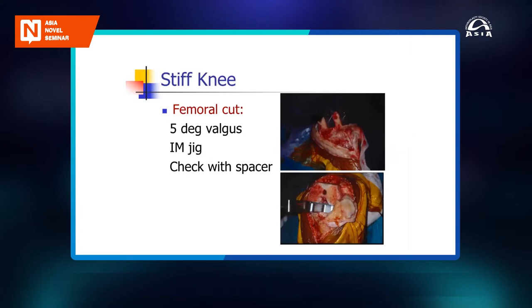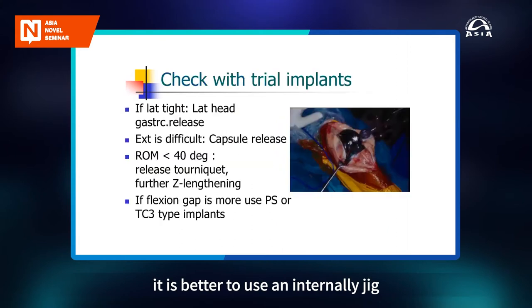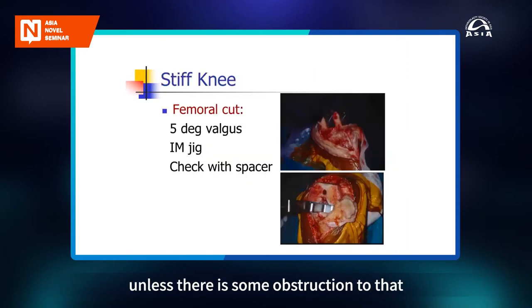As I said, on the femoral side, you make a similar cut, but on the femoral side, it is better to use an intramedullary jig unless there is some obstruction to that. In which case, again, use computer assistance. Obstruction like a plate or a nail, something which you can't remove or don't want to remove and just want to let it lie there, and you cannot put a rod inside. There are two rods. One is a long rod, the other is a short rod. And if there is a plate or a nail coming right down, you can't use either of the rods.